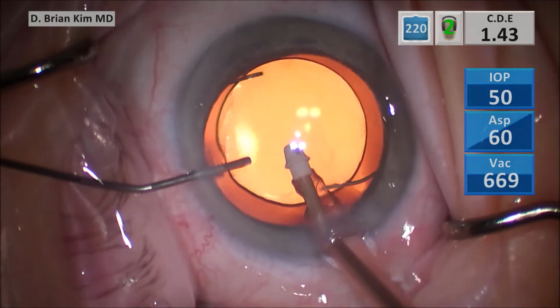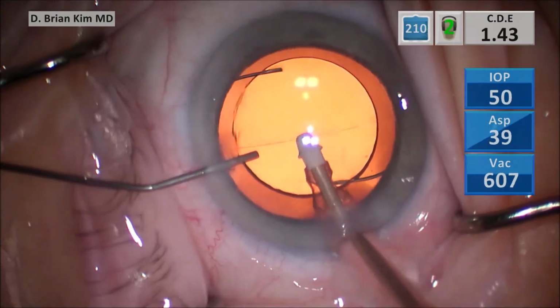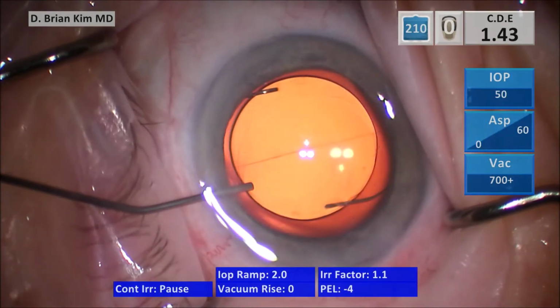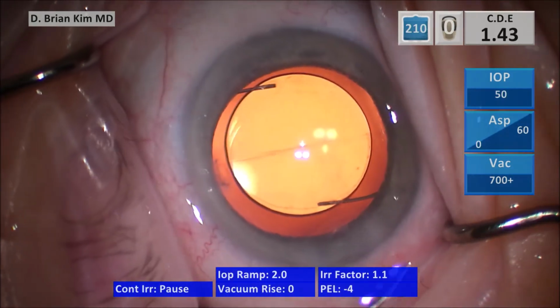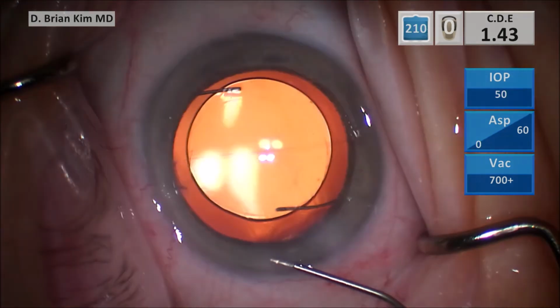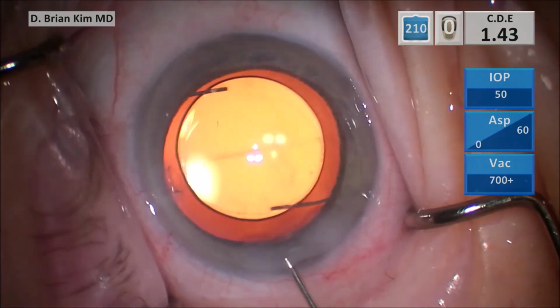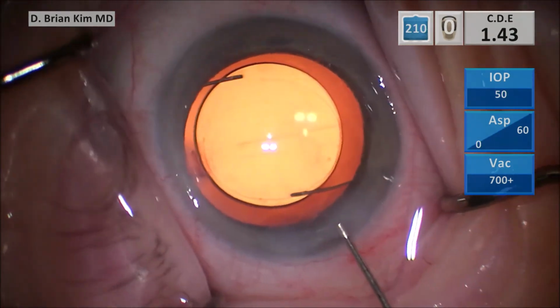The lens was a little bit sticky and a little bit on the dense side, but using mechanical fracturing techniques, being able to hook pieces up out of the bag, crushing the lens pieces, instead of having to push down on the lens, grabbing the lens with high vacuum to impale, I feel like this is just a more efficient way to disassemble this type of lens.